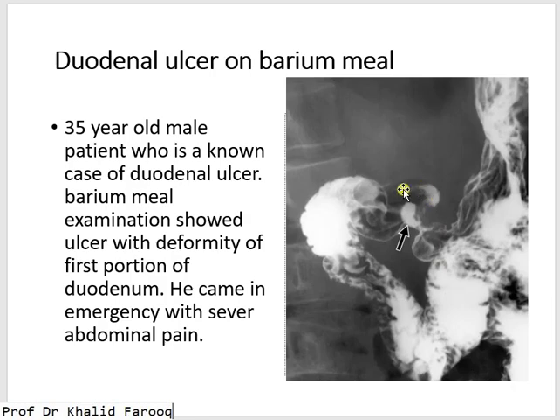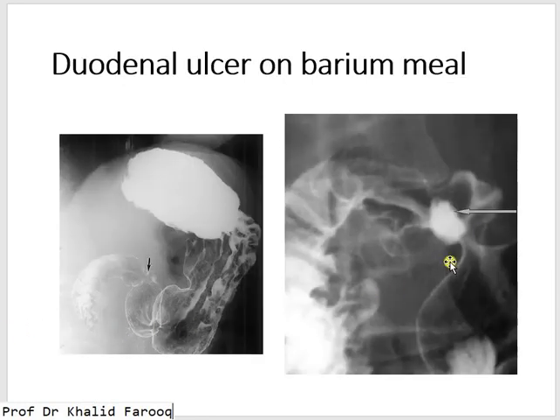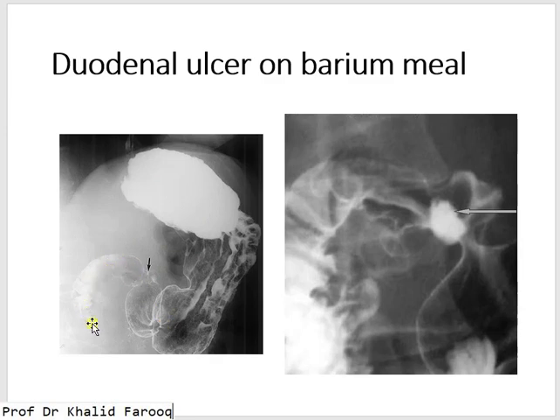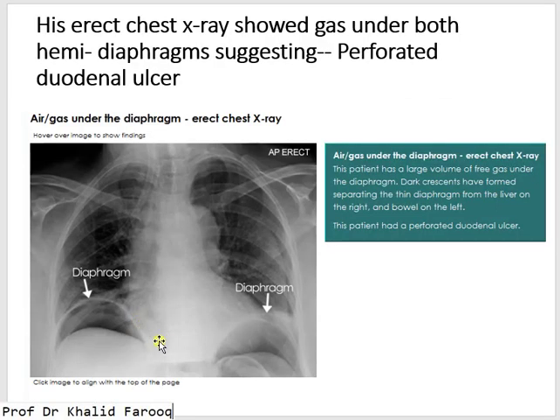Another patient shows an ulcer in the proximal portion, or first portion, of the duodenum — the duodenal cap — where the ulcer is seen and the proximal end is deformed. This patient also presented to the emergency with severe abdominal pain. In a magnified view, the duodenal cap is deformed, mucosal folds are thickened, and the ulcerated area shows contrast filling. In the main view we can clearly identify the ulcer, and here we have multiple examples of pneumoperitoneum — air under both hemidiaphragms.